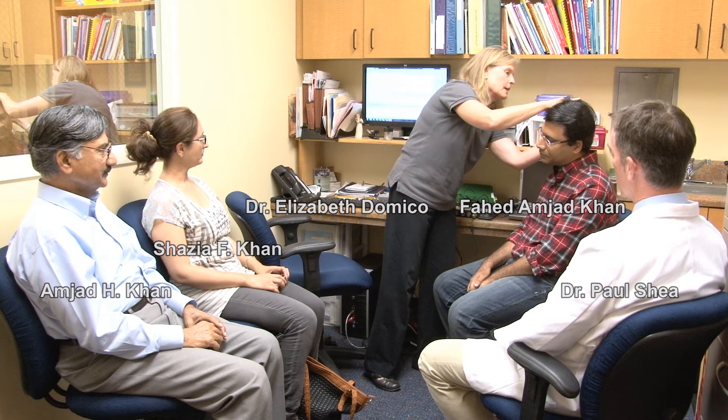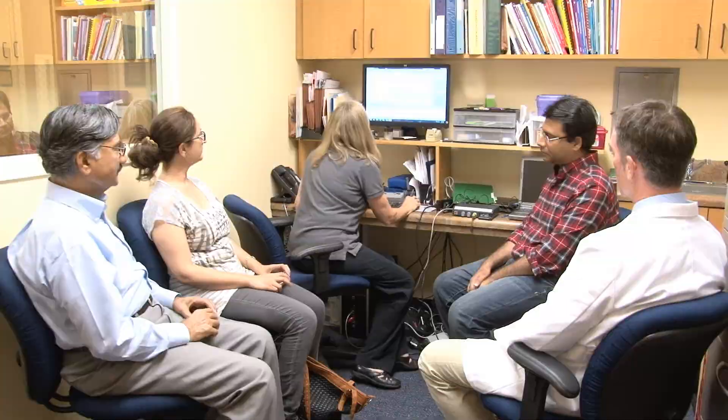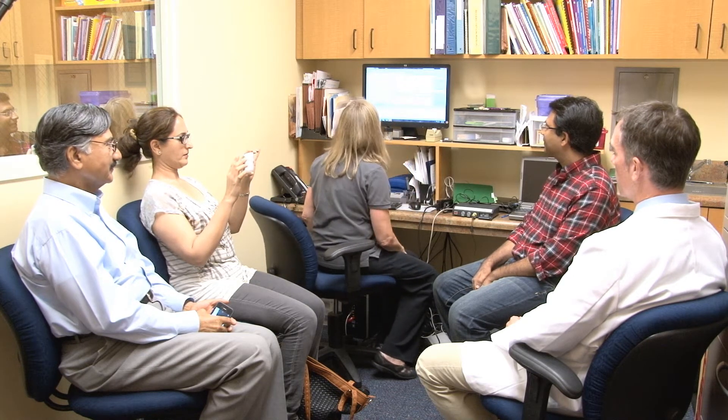What we're going to do first is make sure that the electrical impedances are okay. They were in the operating room — we just want to make sure they are now. Everything looks good still. So everything is where it needs to be. Nothing is open-circuited or short-circuited.